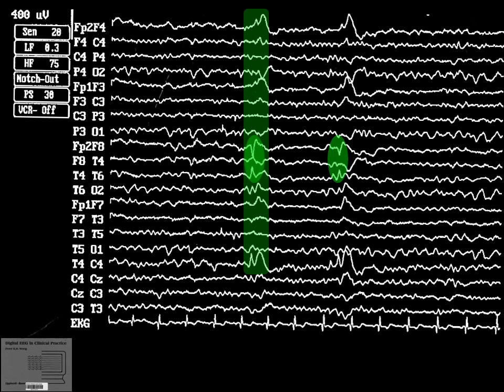It is important to notice that at the same time, other waveforms triggered by the same or at least a temporally linked process manifest themselves at different electrodes, especially as a spike and wave at the T4 and C4 recordings.